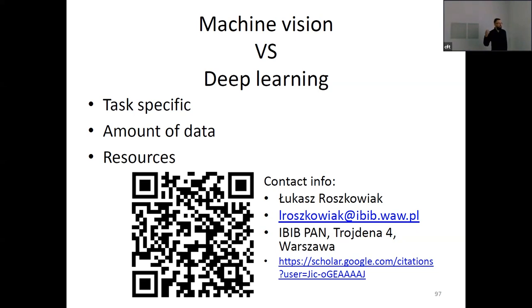But as for the sensitivity to error, well, we want to minimize the errors, of course, but a few examples of bad classifications should not really provide bad results in the whole dataset. For deep learning, if you have thousands of images and about 0.5% of bad labels, it should not provide bad results in the end. It should still be high accuracy. We want to generalize the knowledge, so it should not really be affected that much. I hope that answers your question.